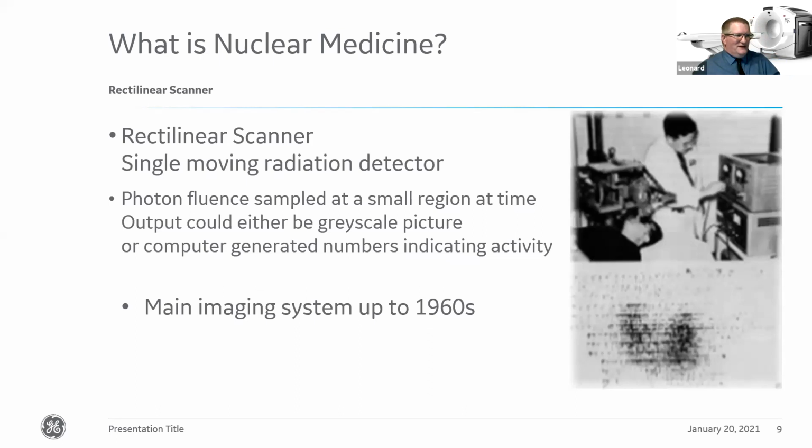So what we've got on here is the pole of the thyroid coming across down behind the neck, down into where we're going into the split, and the other pole and size of the lobe of the thyroid on the other side as well, meeting in the middle as it's coming through. So we're showing here that one side is slightly more active than the other, or we've got an underactive portion of the thyroid, as we're seeing on here.